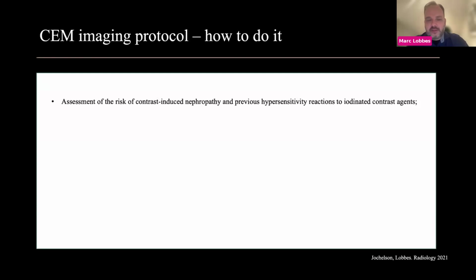It's sometimes a little bit different in parts of the world how they tackle the use of iodinated contrast agents. Some have some local guidelines that they adhere to. But it's important to know that the rules, in fact, are the same for contrast-enhanced examinations when you use, for example, CT. And also dealing with the hypersensitivity reactions is similar to what we have been used to doing for years in CT examinations. So the easiest way to deal with the use of iodinated contrast agents is just apply a protocol that you're used to when you look at contrast-enhanced CT examinations.